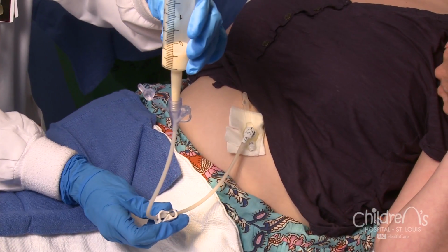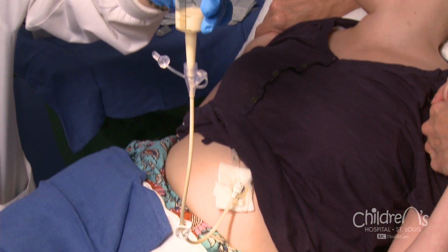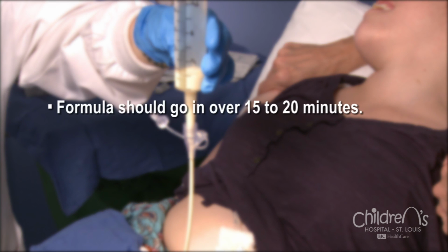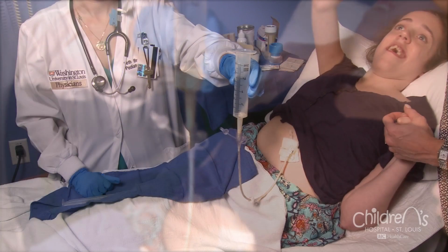Open the clamp on the extension set. Raise the syringe until the formula flows in slowly. You can decrease the rate by lowering the syringe if needed. Formula should go in over 15 to 20 minutes. The formula may come back into the syringe if your child is fussy or crying. Just wait a few minutes, and then the formula will go in again once your child calms down.